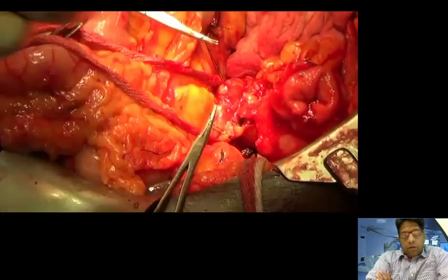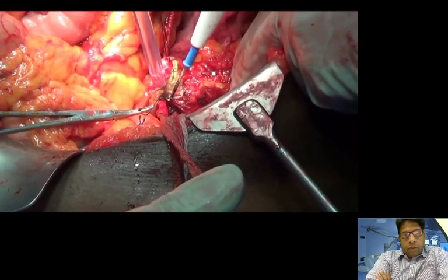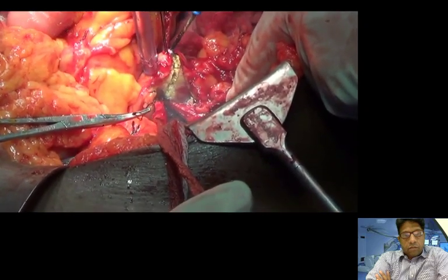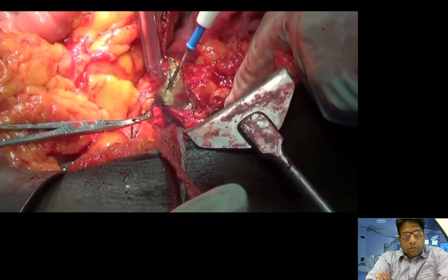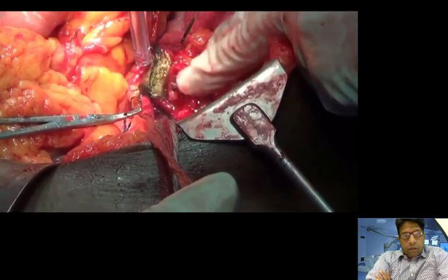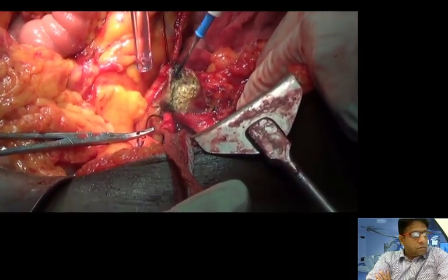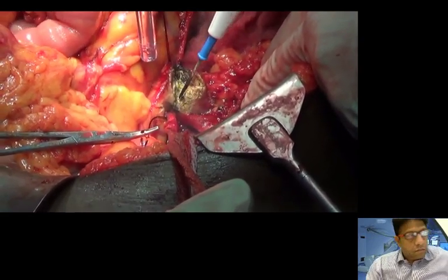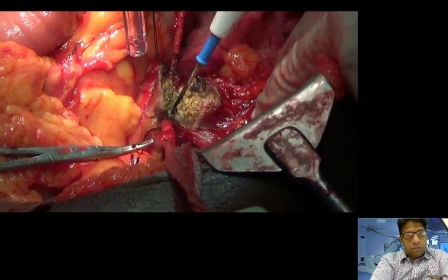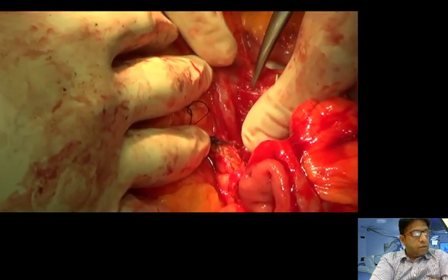In this video, they don't actually show the dissection of the posterior aspect of the pancreas, creating that tunnel. And that's pancreatic parenchymal tissue that's being transected. That's pancreas transected. And to mobilize the uncinate process.